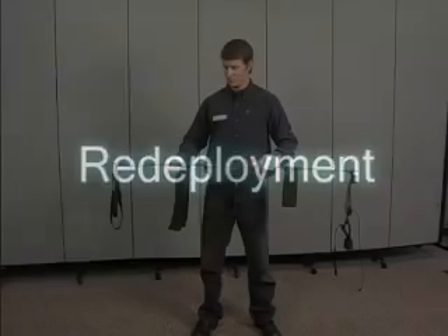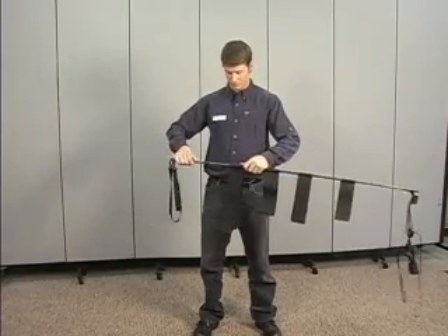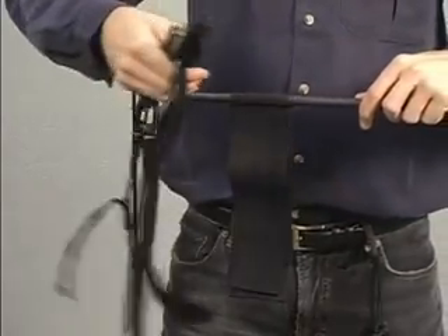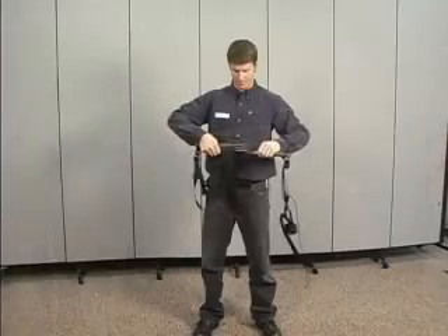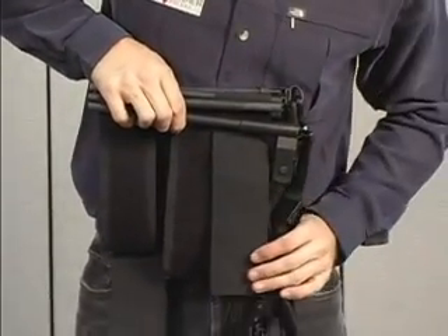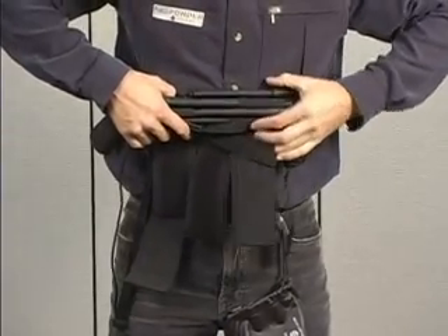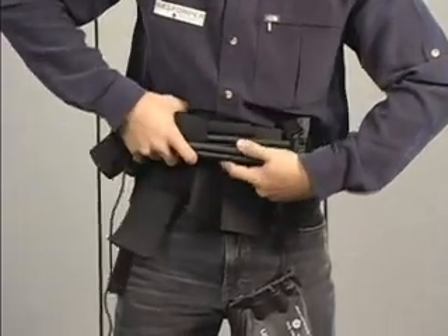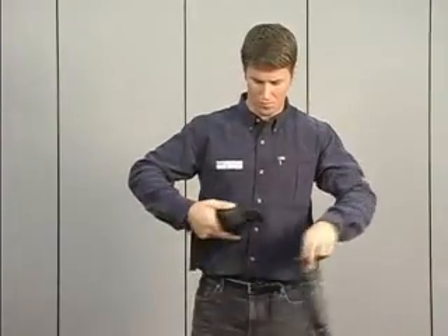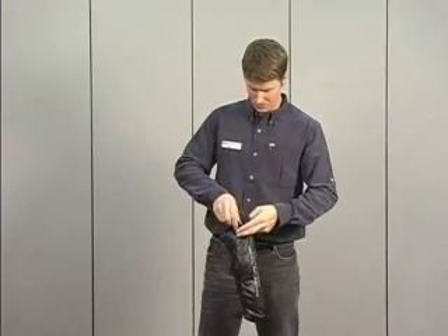Redeployment is greatly aided by proper packing technique. From one end, begin disengaging each tubing section one at a time, folding them back on top of itself. Keep the straps straight and in line. Next, fold the ischial strap and ankle hitch next to the tubing. Now, tightly roll the splint, allowing the leg straps to wrap around the entire unit. Slide it into the bag, keeping the straps wrapped around the splint. Finally, close the bag and tighten the cinch strap.